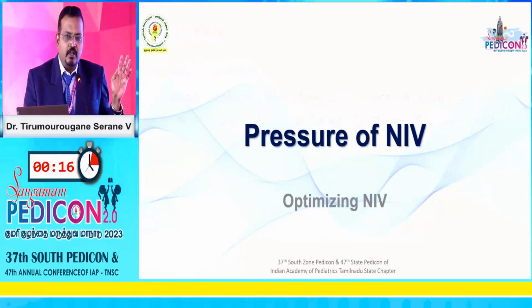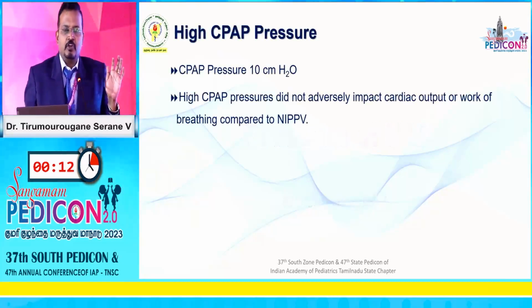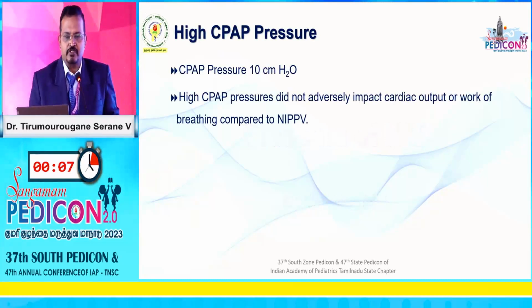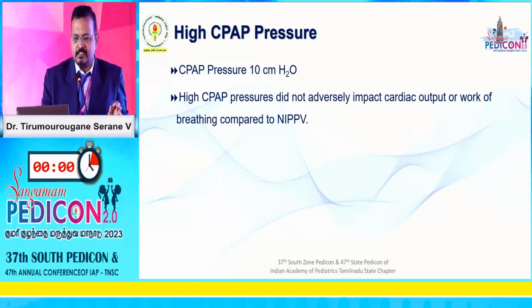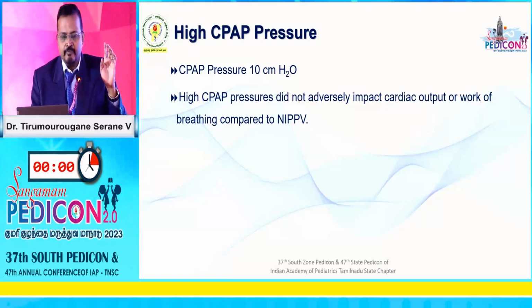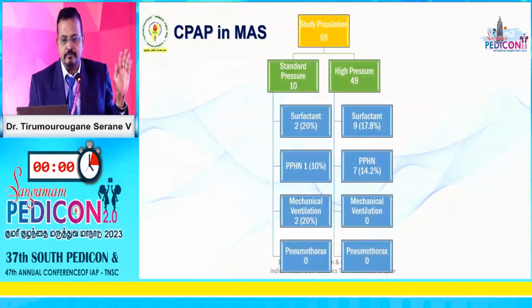Now, this is something which I love, and probably I can make myself very controversial here. Most people get scared when they use a pressure of anything more than 5 to 7. I am very happy my unit standardly follows 10 centimeters, and I will shortly show you the results of my unit. The pressures could be as high as 10 centimeters, and there are studies to show it does not have a cardiac impact or an impact on work of breathing. So it's not bad.